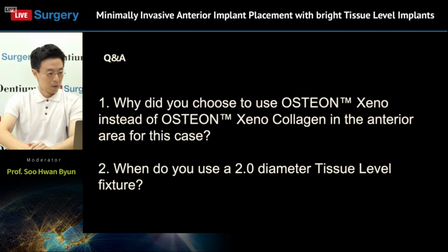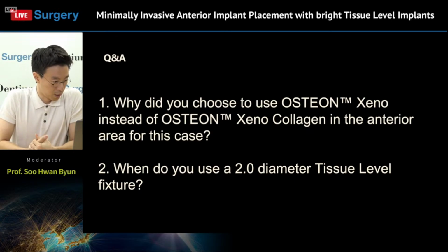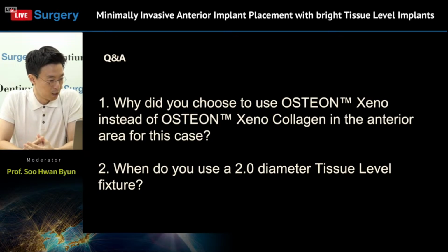Now, let me show you the questions. We have 2 questions. The first question: why did you choose to use the OSTEON Xeno instead of OSTEON Xeno collagen in the anterior area for this case?